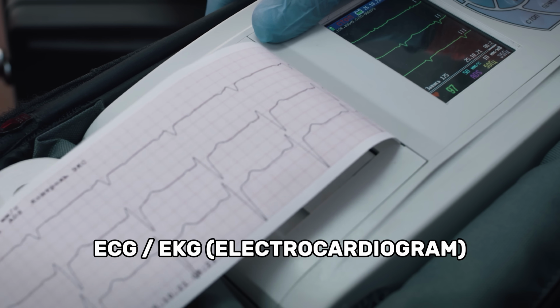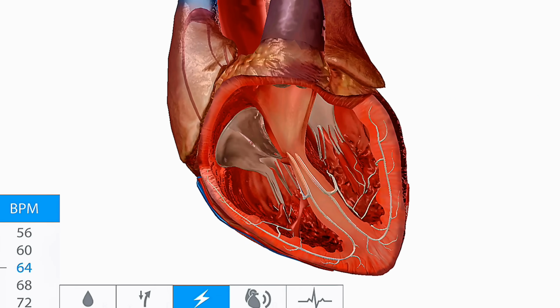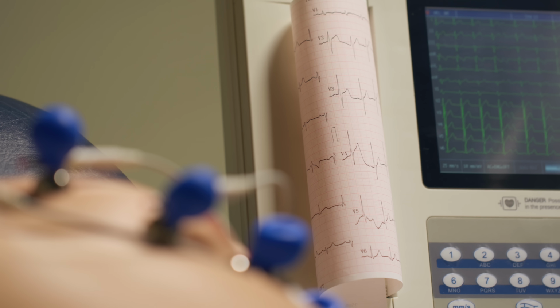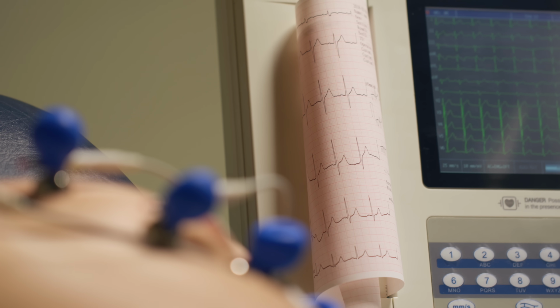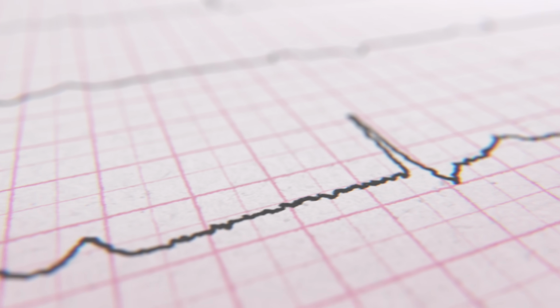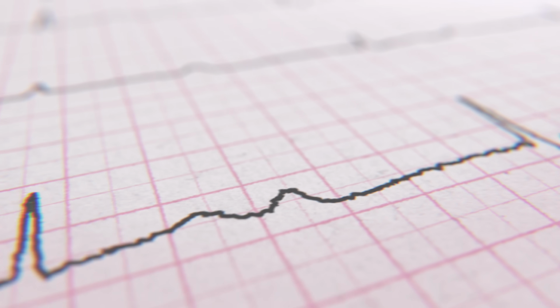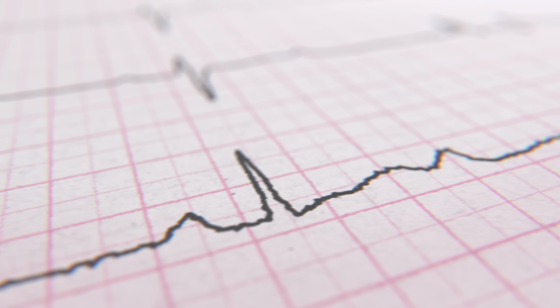It's a 5-second snapshot, an electrical picture of your heart. It's painless. You put a few stickies on your chest, 10 stickies to be exact, and it's a simple test. It tells us what the rhythm of your heart is. It might tell us if you've had an old heart attack. At times, in the middle of having chest discomfort, it might tell us that you have a blocked artery, for instance. So it's a good starting point for us, but of course it's not the end of the story.